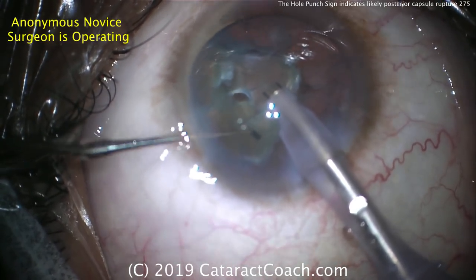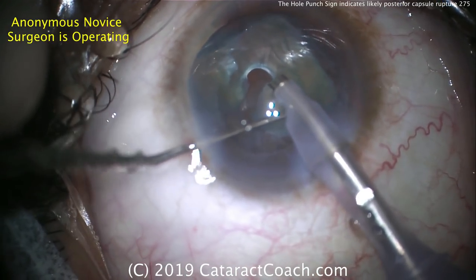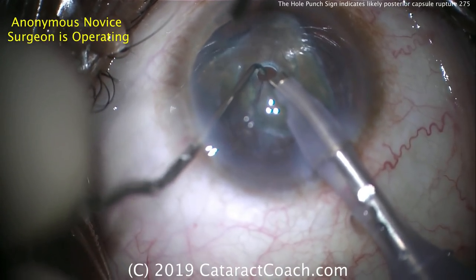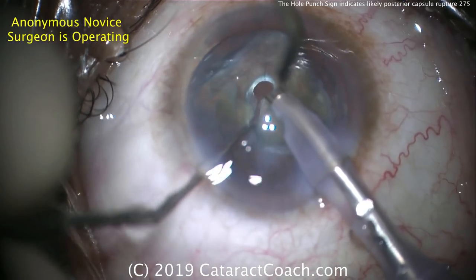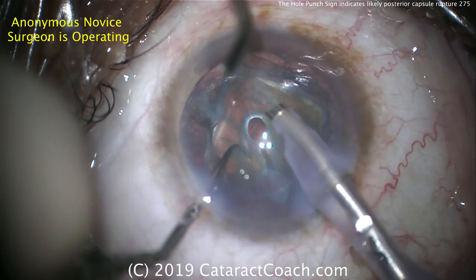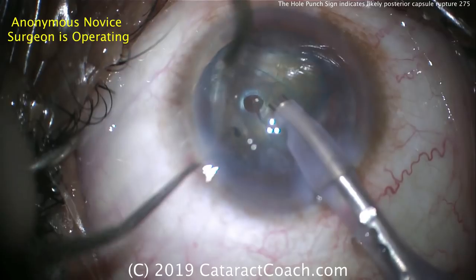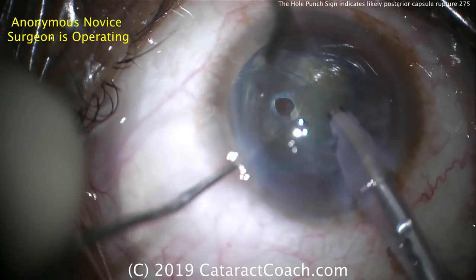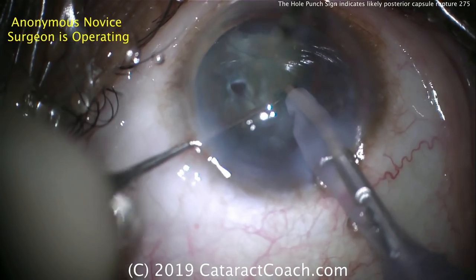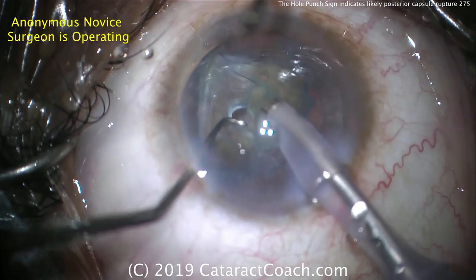That hole punch means the phaco probe went through the cataract piece, through the nuclear piece, and almost certainly hit the posterior capsule. So don't let this piece fall back in the eye — get it out. Get a little bit of vacuum, hold that piece, but that big punched-out hole is your danger sign. If you roll back the video and rewind a little bit, you'll see that bright orange-red reflex through that tiny hole as it was being punched out.